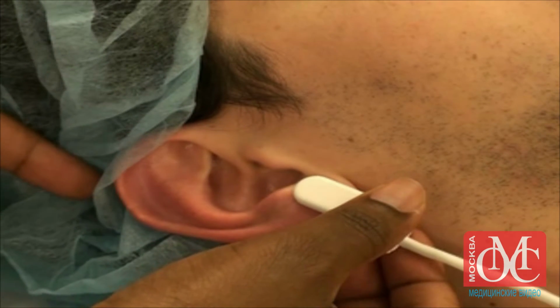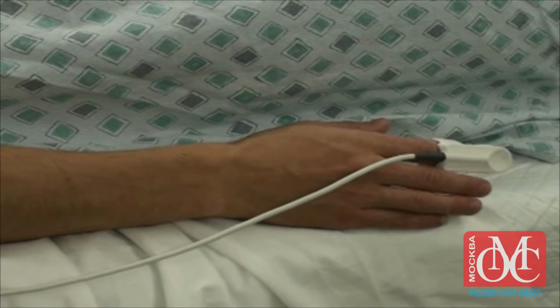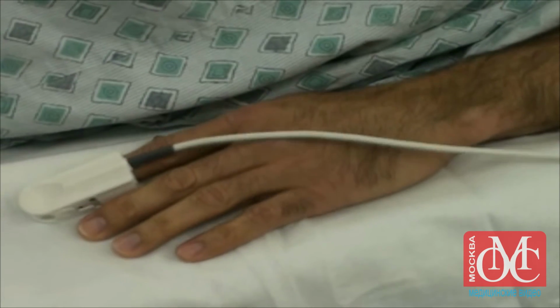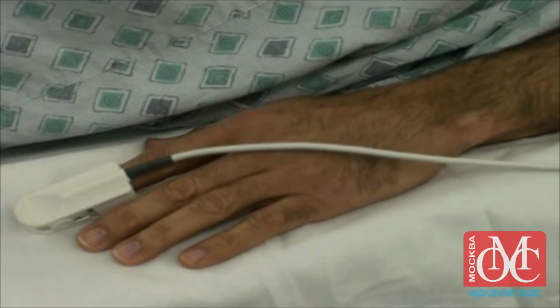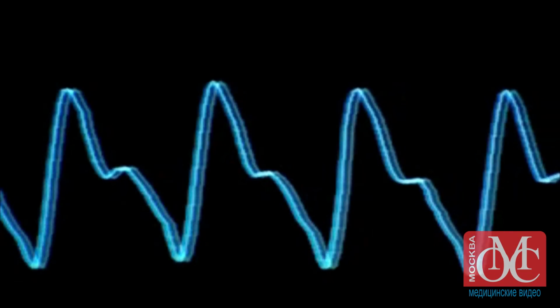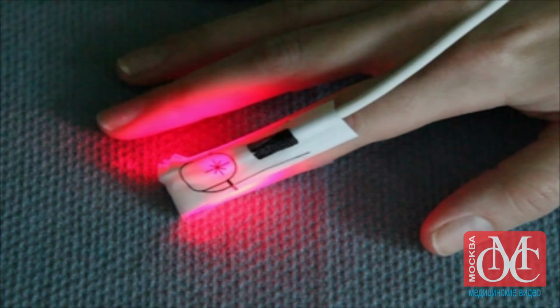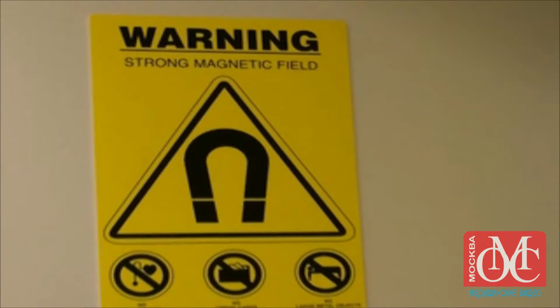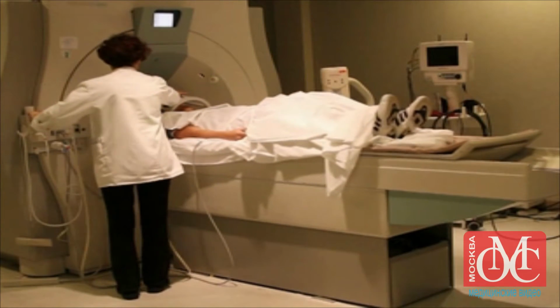Even though it is easy to use, the pulse oximeter can produce erroneous data in certain circumstances. One common problem is the occurrence of movement artifacts when there is movement at the site where the probe is placed. This may interfere with proper function and most often occurs if a patient is shivering, has seizures, or is being transported by ambulance or helicopter. The waveform of the pulse oximeter will be distorted in such circumstances, and the clinician should recognize that the measurement displayed is inaccurate. A bright light, such as an operating room lamp, may cause light interference, leading to an erroneous reading. Electromagnetic radiation, such as that emitted from an MRI scanner, may also interfere with pulse oximetry.